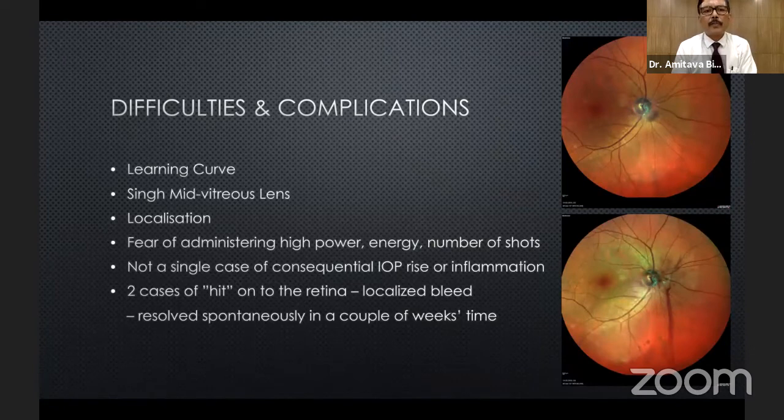I just want to touch upon that there is a learning curve. It is a very simple procedure. I think anybody can take it up. It's like any other YAG laser machine. There are lights, you have to focus, and you have to shoot. As Dr. Singh pointed out, spatial awareness is very important. And when you taught me hands-on, my own spatial awareness has improved a lot, and my confidence has improved. Thank you so much.